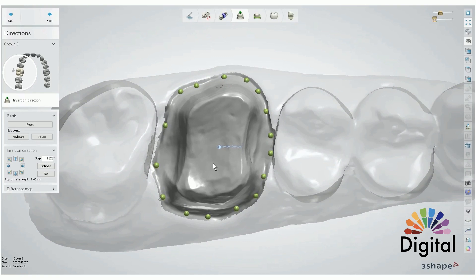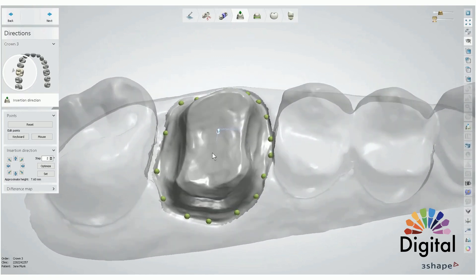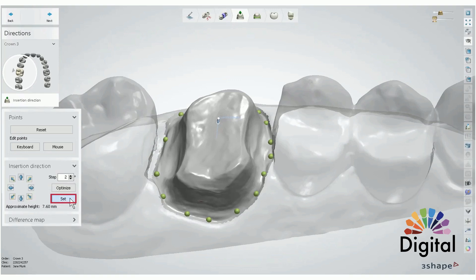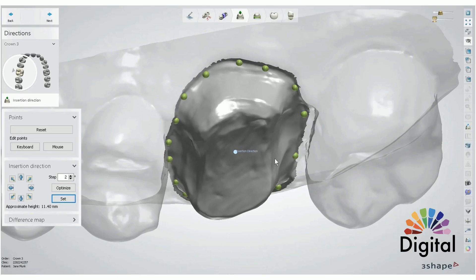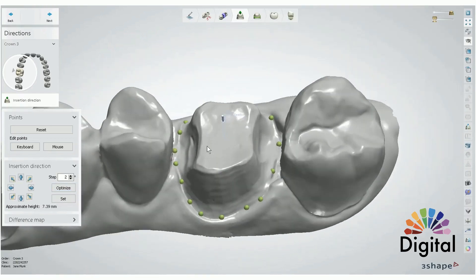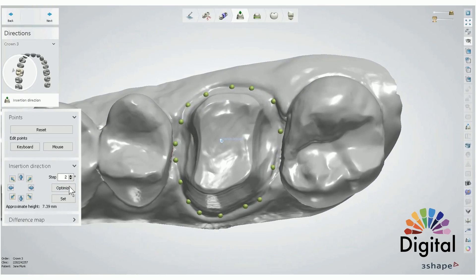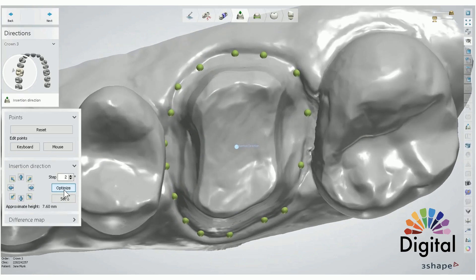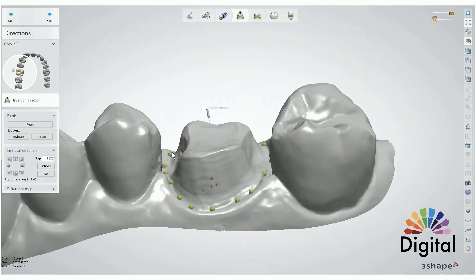If you want to change the insertion direction, we can use our view direction setup — we can tilt the direction and simply click the Set button on the left, and the direction automatically changes, which will also change the undercut area. Click Optimize to go back to the first setting. For a simple change, we also have some arrows to change the insertion path. Usually this tool doesn't need to be used. Click Next.